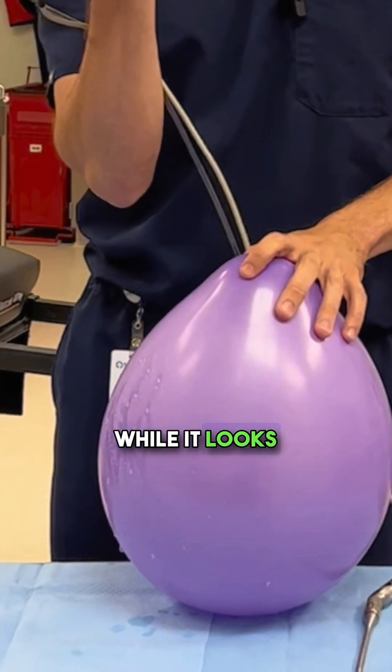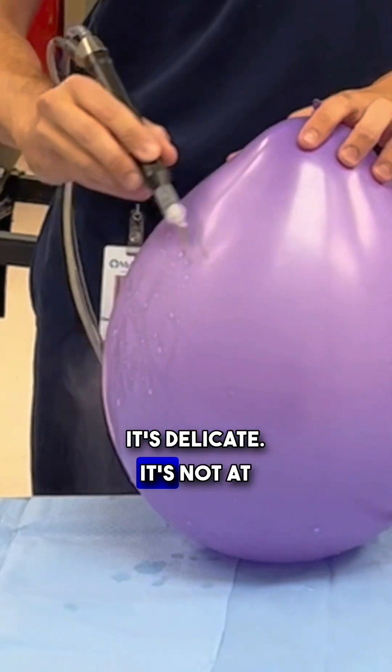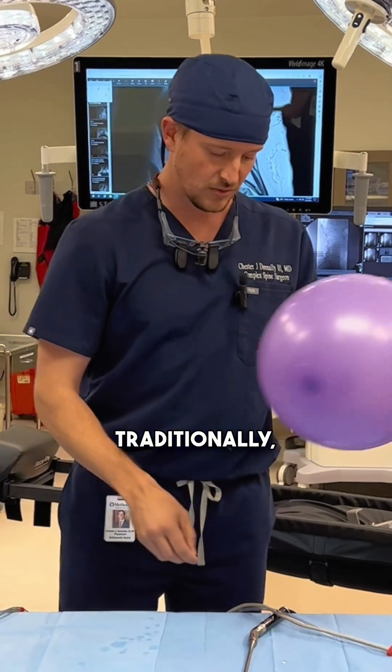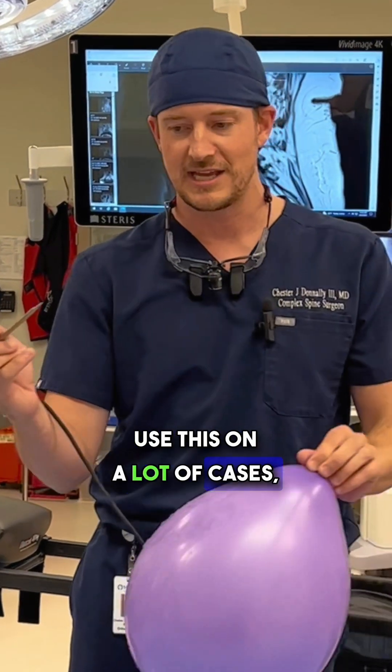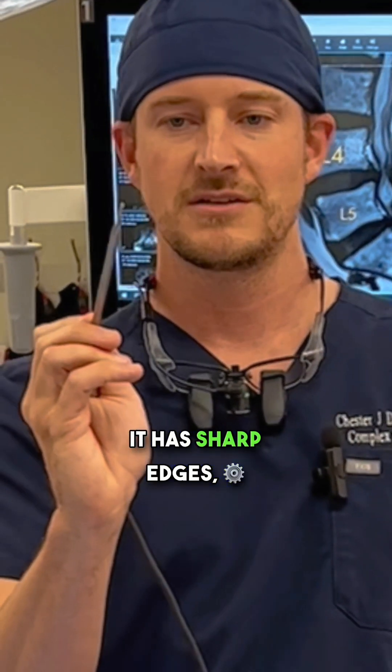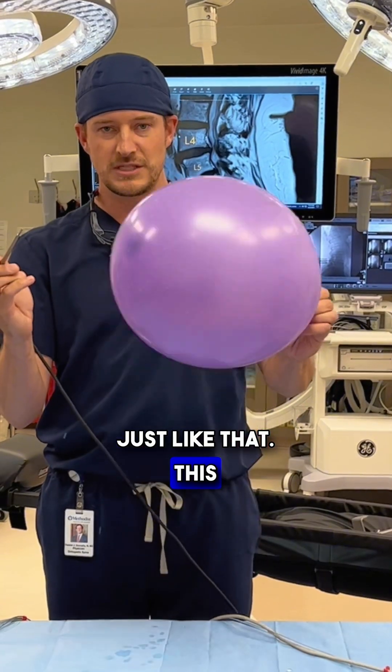Using a tool like this, while it looks sharp, it's delicate. Traditionally, what many, many spine surgeons use — and I still use this on a lot of cases — is a burr. It's a rotating burr. It has sharp edges, just like that.